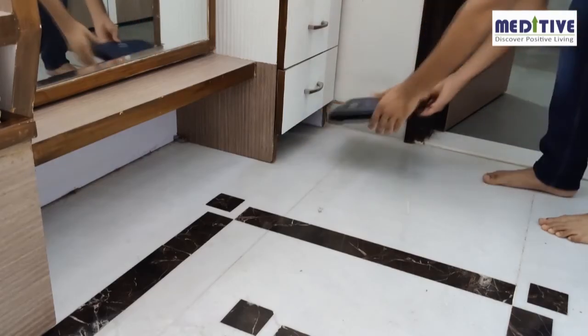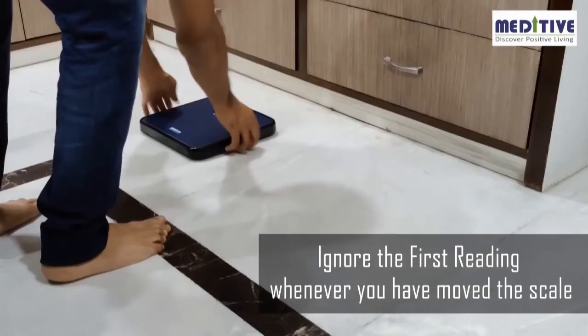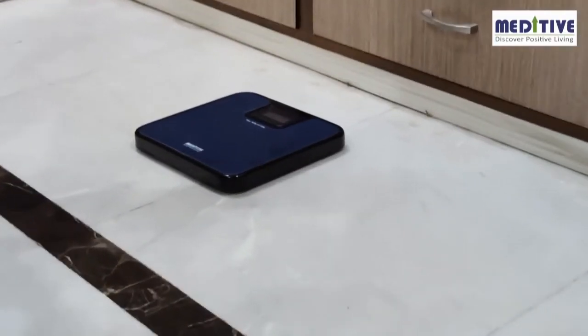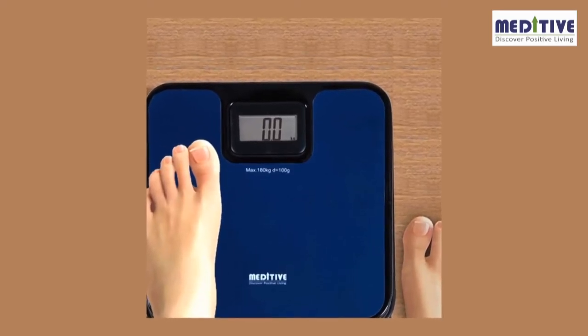Please note: whenever you move the scale from its position — for example, if you keep it under a cupboard or table and take it out the next day, or pick it up, slide it, or shift it on the ground — you should ignore the first reading and take the second reading. We hope you like our product. You can always reach out to our customer care number for more assistance.